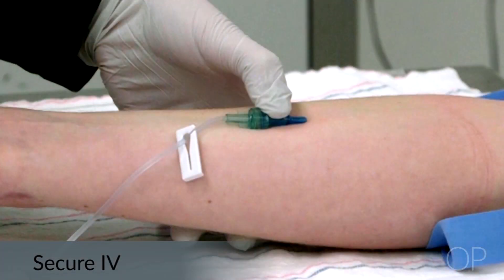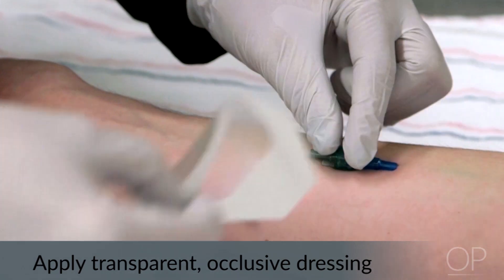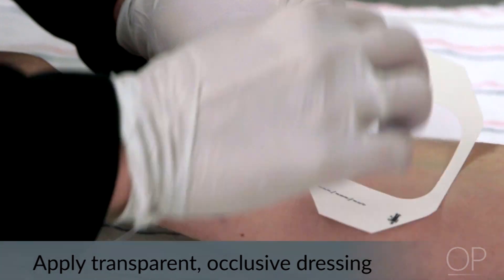Next, we'll talk about securing the IV. If the connector has a metal or thick end, place a piece of gauze under the end before putting the dressing on to protect the skin from breakdown. You'll want to dress the site with a transparent occlusive dressing.